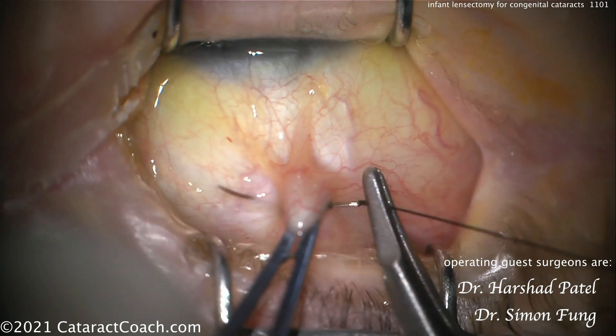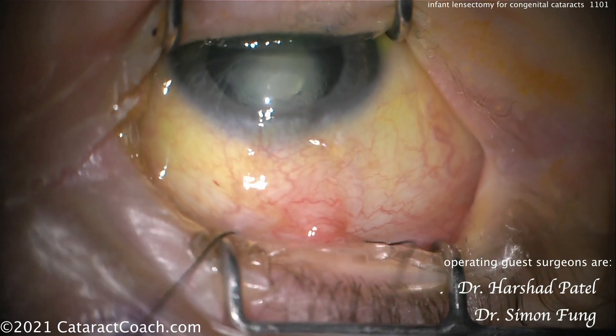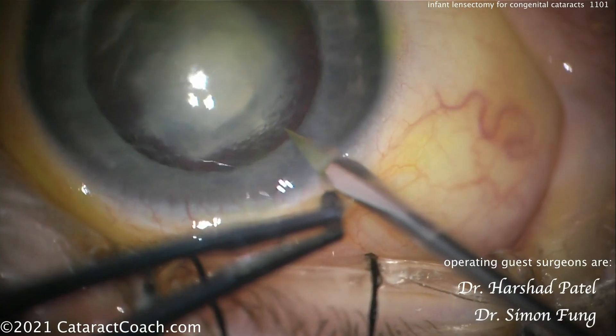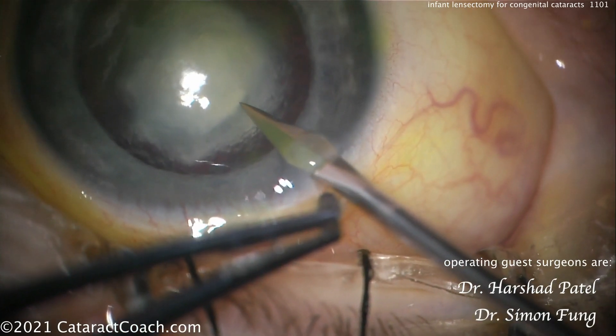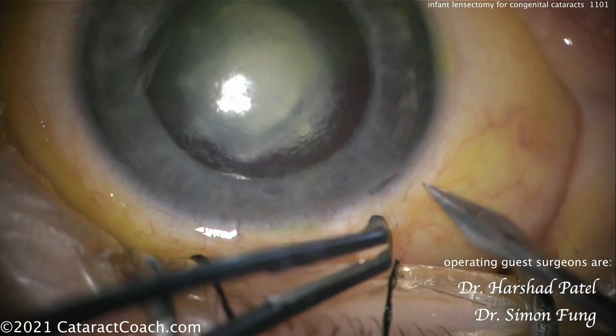You can see there's that central opacity — obviously a very significant cataract. This is something a little unusual: a superior rectus suture to help fixate the eye. The baby is under general anesthesia, but if you want to be extra sure, I suppose we can do this as well.